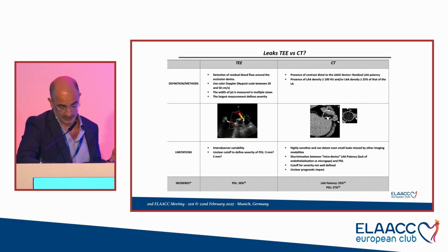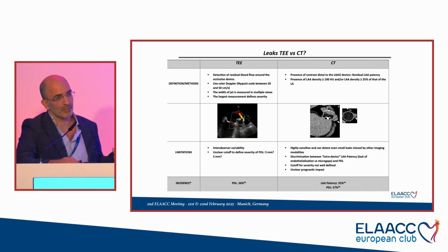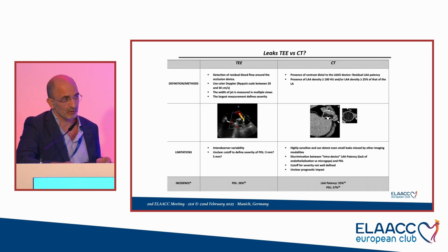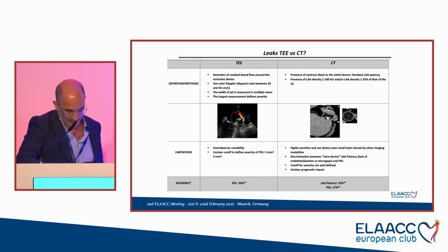But the problem is, it's highly sensitive. It can detect even small leaks missed by other imaging modalities, so basically TE. You have to discriminate between intra-device leak or really peri-device leak. And some people now say that you cannot use the term intra-device leak. It must be lack of endothelialization. The cutoff for severity is really not well defined because you don't have any studies showing the prognostic impact of a CT-detected leak. And so that's a problem.